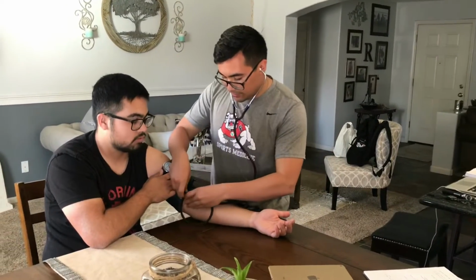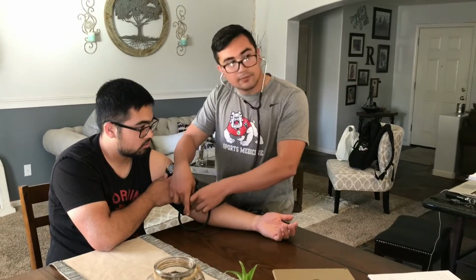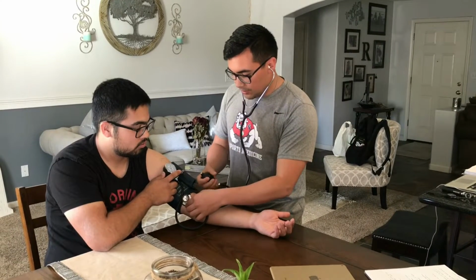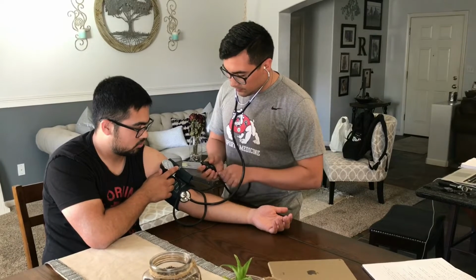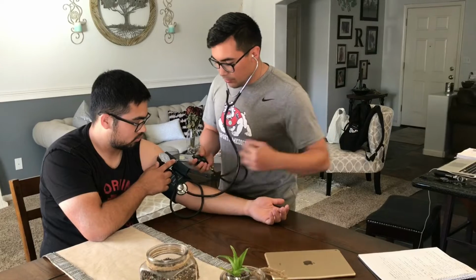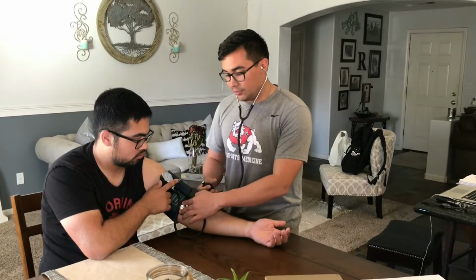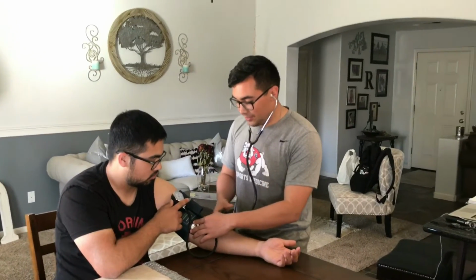I'm going to put it right on his brachial pulse, which is about right here. I'm going to make sure this is closed. All right. And then I'm going to hold this down on his brachial pulse. One thing you want to make sure you don't do is put your thumb over it, or else you'll end up taking the pulse of your thumb.